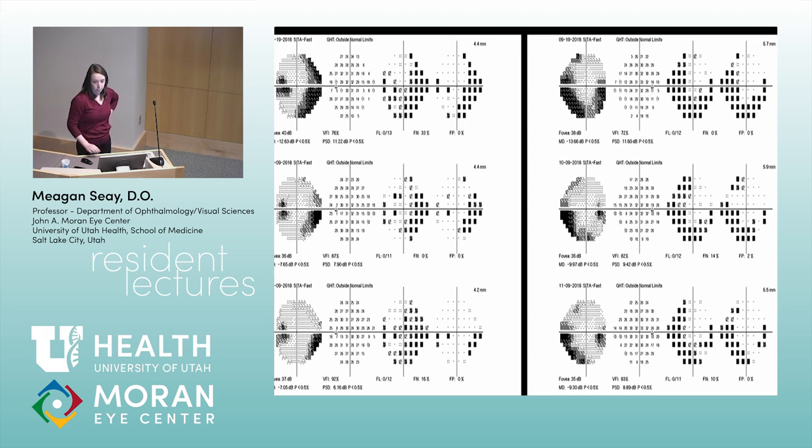I have a question about that, Dr. Seay. This might be wrong too, but there's a question that I just had that said, what's the most common visual field defect seen in IIH? The answer is partial arcuate, with or without enlarged blind spot, and then enlarged blind spot being the second most common. Is that true? My experience, I feel like enlarged blind spot is most common.